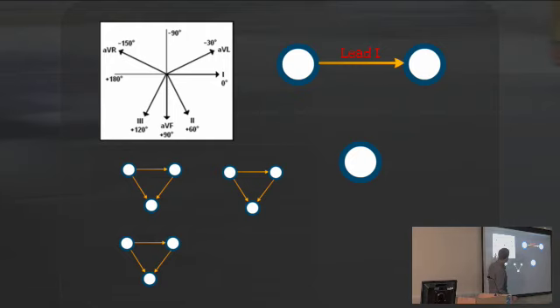So for lead 1, remember we've got a sticker here and a sticker here. For lead 1, this is the negative electrode on your right shoulder, and this is your positive electrode on your left shoulder. You're simply looking across, so it's going straight across. That's why that is what we call 0 degrees, straight across there. That's lead 1.